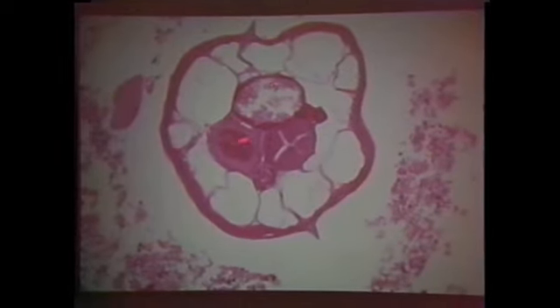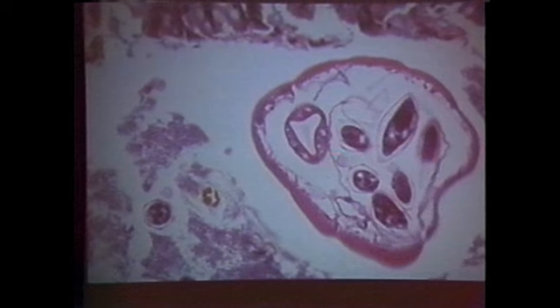Look at this. What do you think this is? This is a female. These are reproductive tracts. That's your intestine. Look at the demarcation between the cytoplasmic and the contractile portion. Here is a female with eggs. Look, these eggs are starting to look like what you learned in vet school.